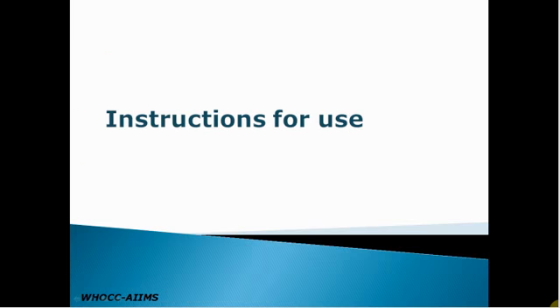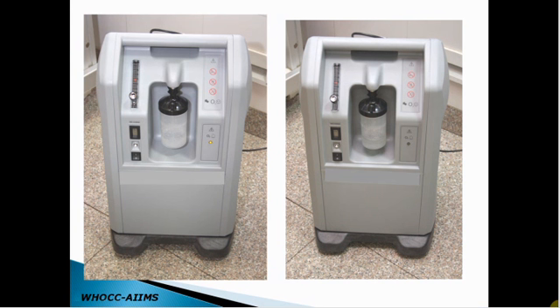It is important to know about the proper use of oxygen concentrator. We will now discuss the steps for using the machine. Once you have plugged the power supply, switch on the concentrator using the on-off button as shown. Once the concentrator is on, a yellow light will come up. Next, adjust the flow to 3 to 4 liters.